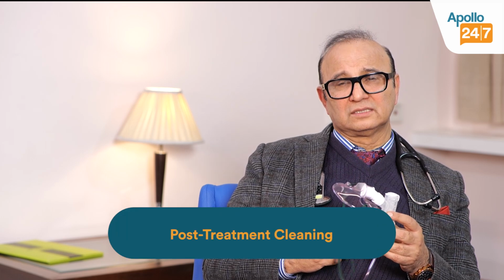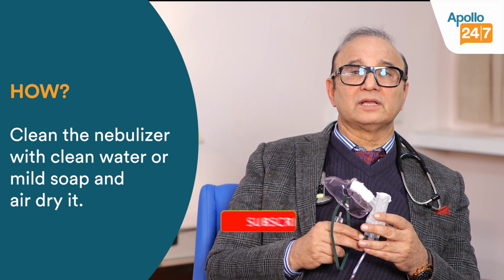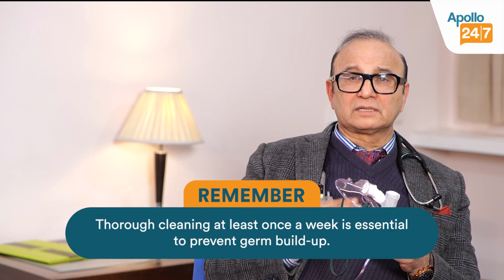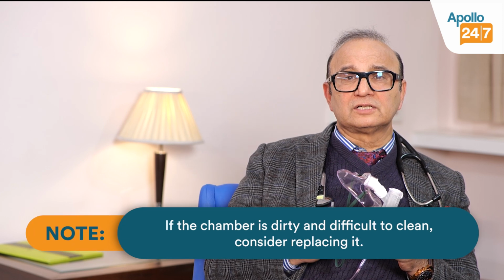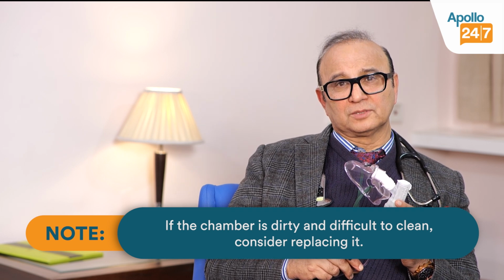After this drug has been delivered, you must clean your nebulizer, either with simple water, or you can even use mild soap to clean it and put it for air dry. It is very important to maintain the nebulizer chamber well. People use it for weeks together and do not clean. But this should be thoroughly cleaned at least once a week. And if it is dirty and the things which you can't remove, then it is better to discard and use the new disposable nebulizer chamber.